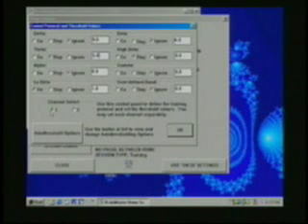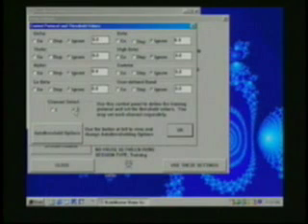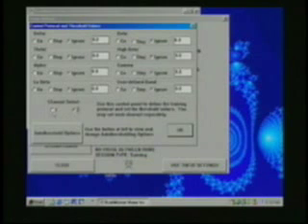It's possible to choose a protocol for channel 1 and a separate protocol for channel 2 when you're doing two channel training. And by using this push button on the left and the right you choose between the channels and set the protocols correspondingly.